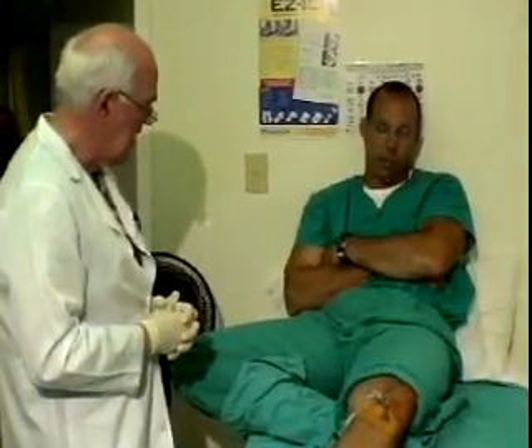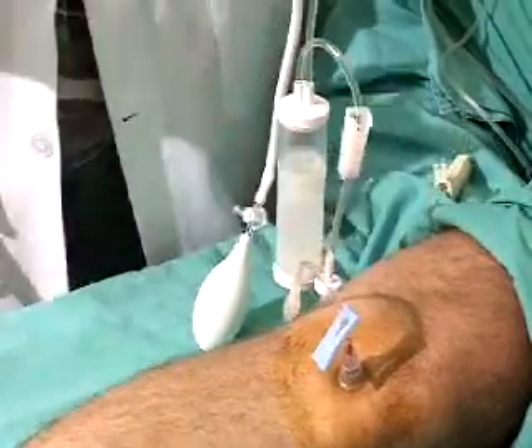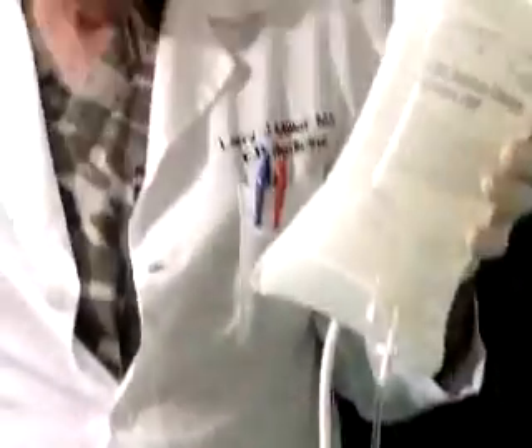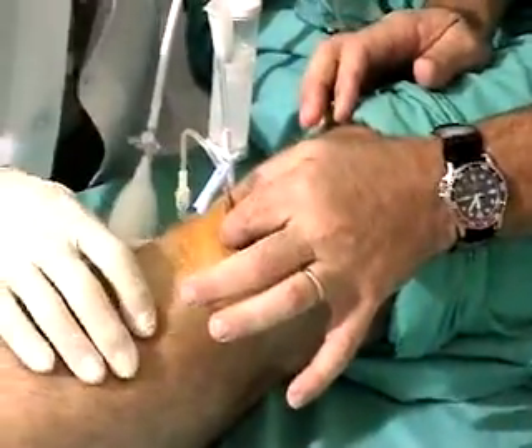I've had IVs that hurt worse than that. Fifteen per six seconds times ten is a minute, so that's 150 per minute. Yeah, it's totally zero, totally flat. It's good and stable. I feel absolutely nothing around it.